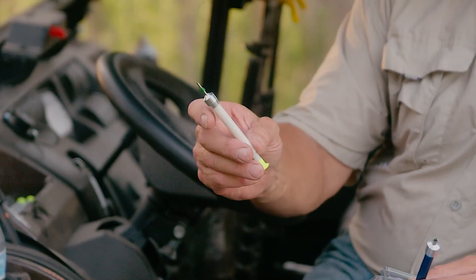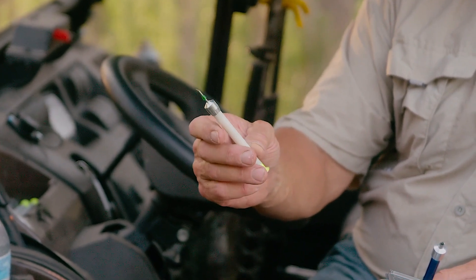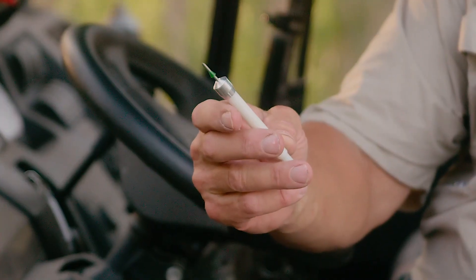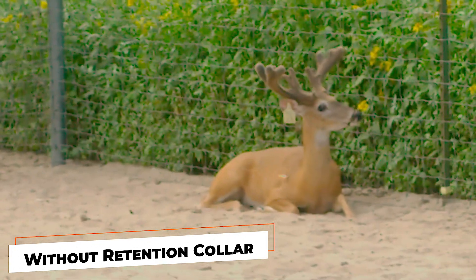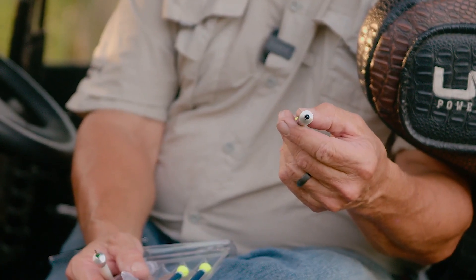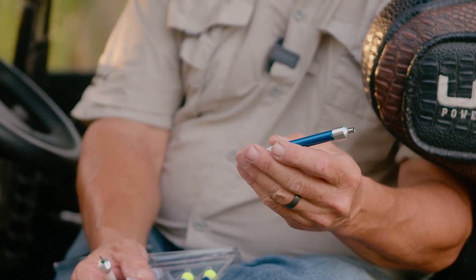If you take a look at it, the white one has a little green — it's actually called a retention collar on it. What that retention collar is for is so it stays in the animal to make sure the drug is all discharged into the animal. Without that little collar, many times the drug does not get 100% into the animal. So if you're going to use an RDD, use one that's got a gel retention collar. This DNA dart does not have the retention collar — all it's going to do is collect a small sample of deer hide and fall to the ground.